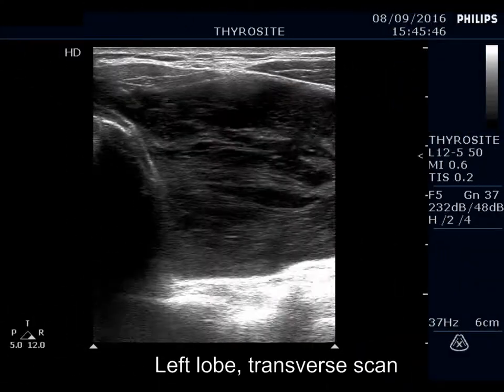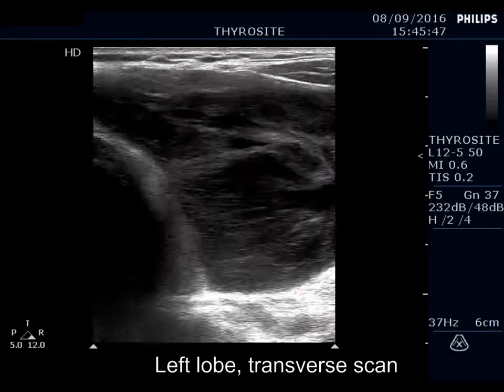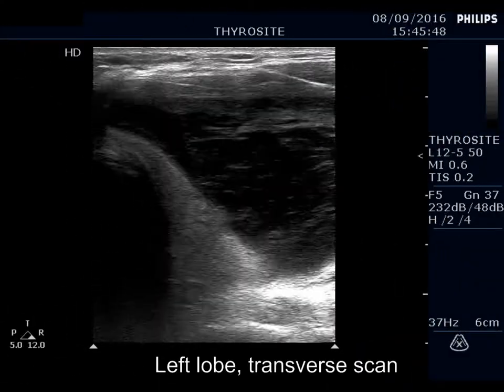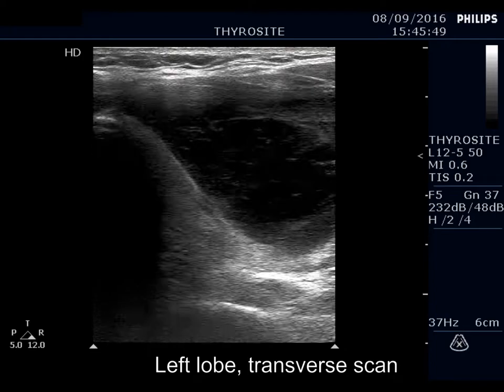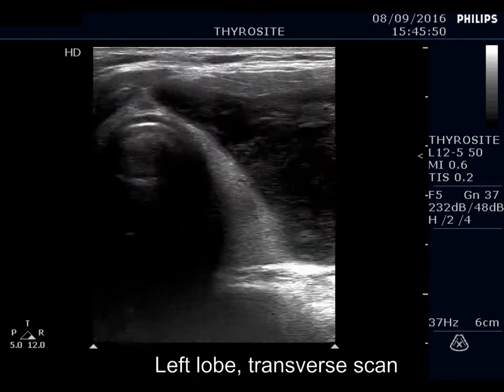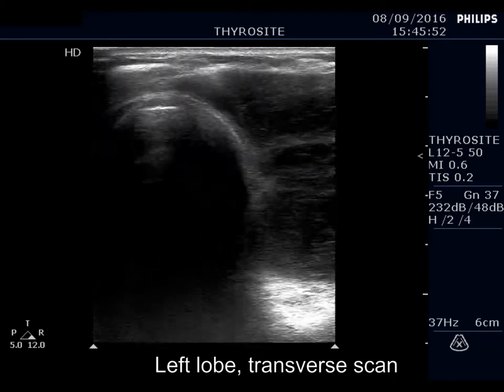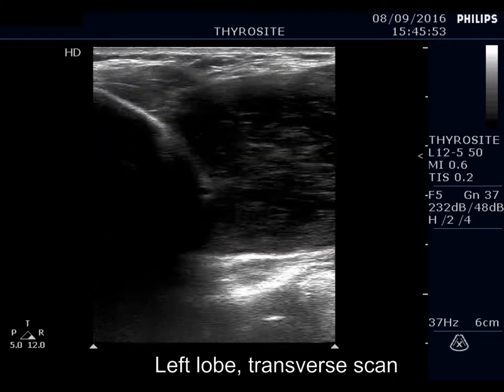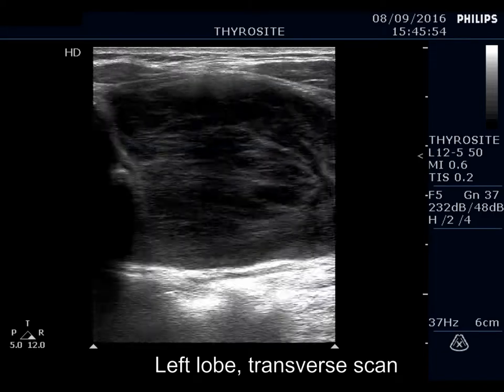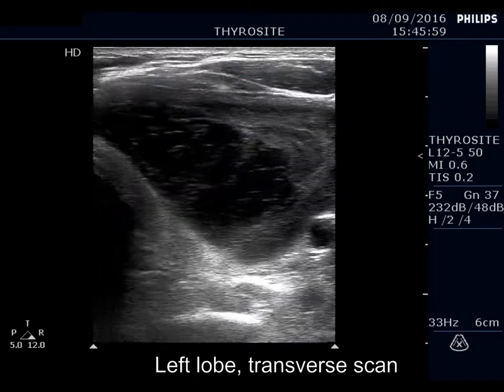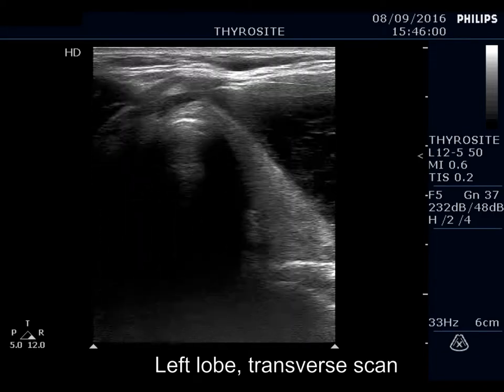There is a large hypoechoic mass in the usual location of the left lobe. The thyroid is compressed and displaced dorsal and medial.